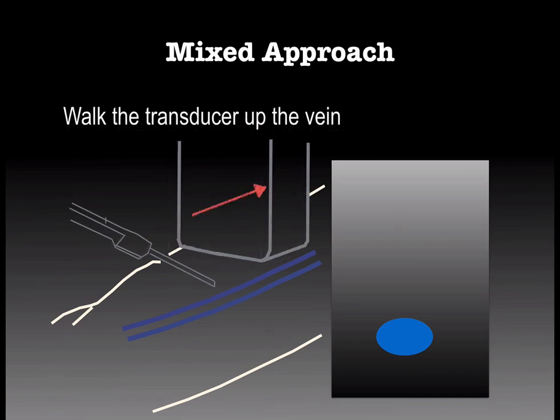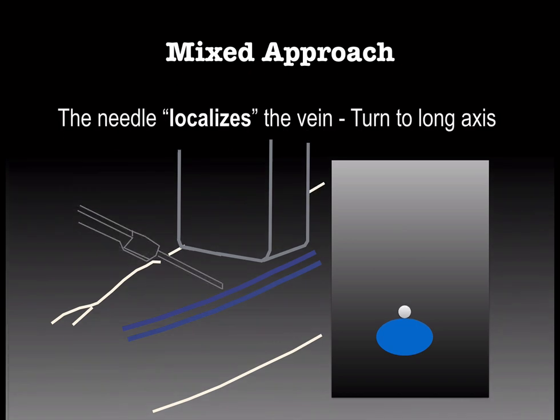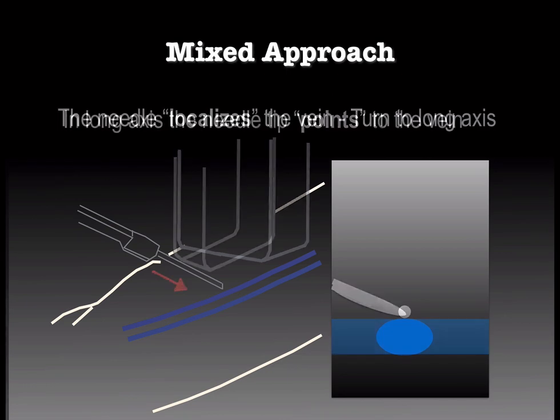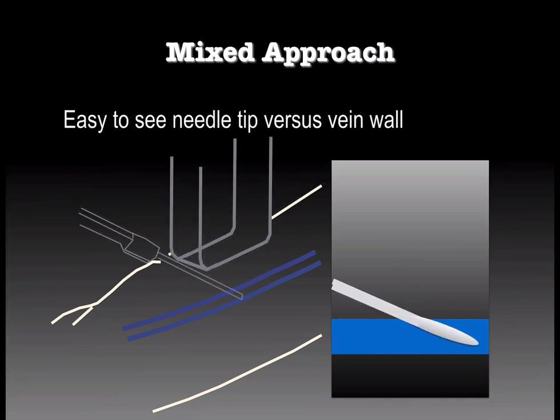Now move the transducer. The needle is going to disappear because we've gone beyond the needle tip, and then advance the needle until the tip is seen. When the needle is pointing towards the vein, when it's anywhere close, we can take our transducer off and we can go find the needle in long axis. The needle is pointing to the vein, and then we can finish our procedure off by sliding the needle through the vessel wall and assuring we have great placement of our needle.